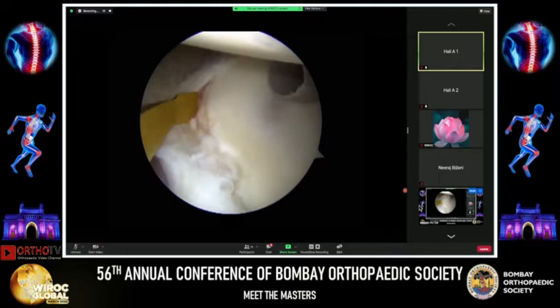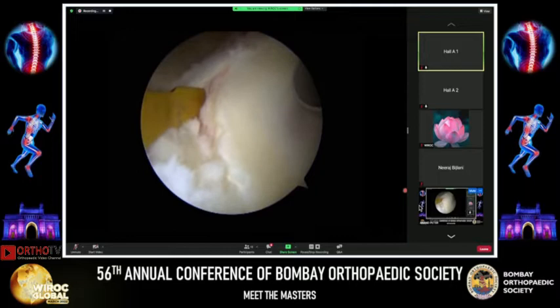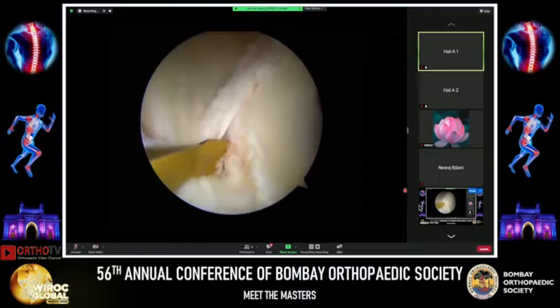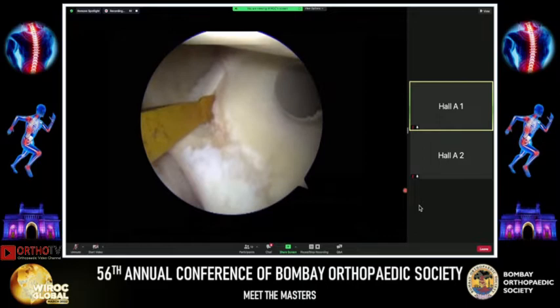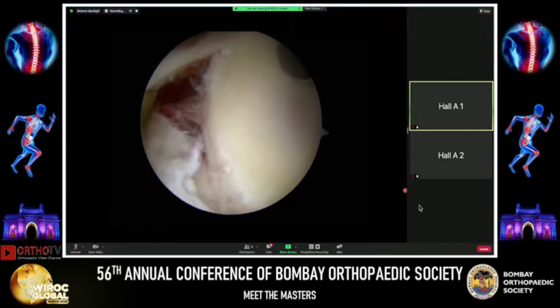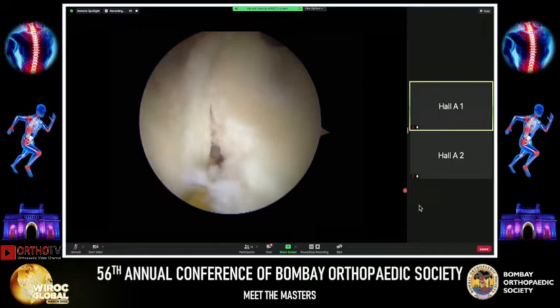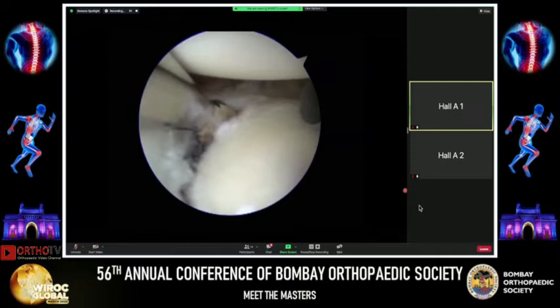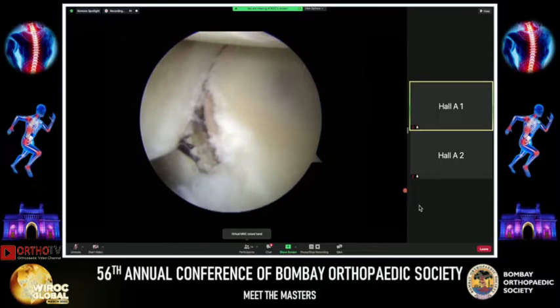Once the diagnostic part is over, we move to the second part: the release and preparation. I put a soft tissue liberator from the anterior portal and release the labrum and capsule, ensuring enough soft tissue for adequate retensioning. Finding the appropriate plane between bone and soft tissues, I release all of the anterior labrum with the capsule off the glenoid.